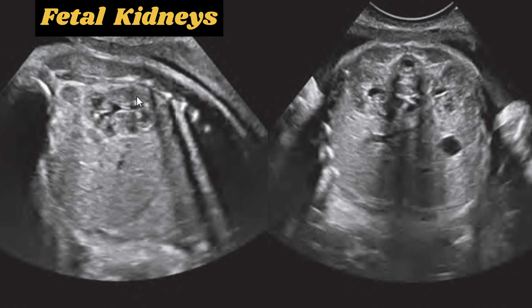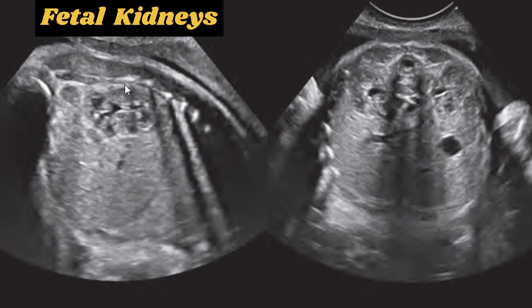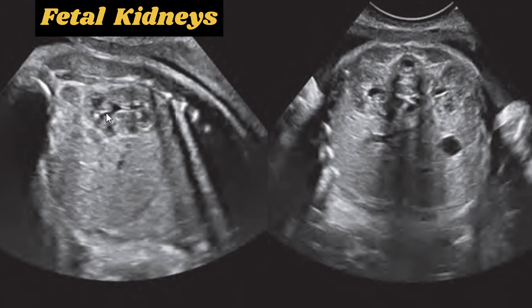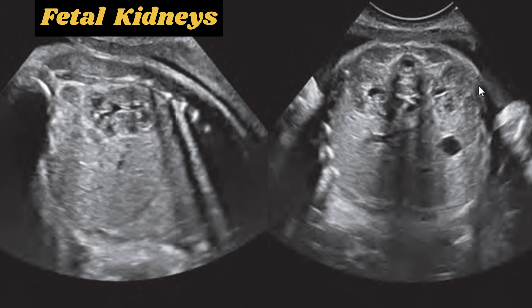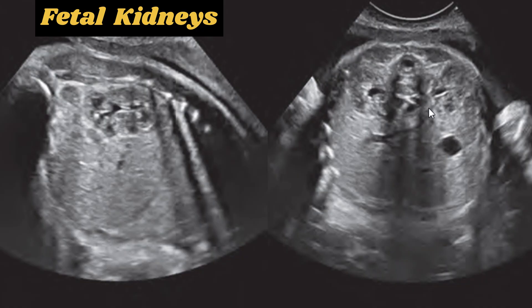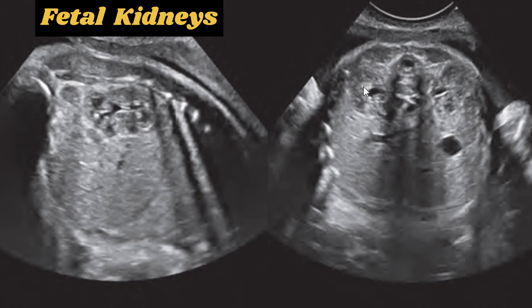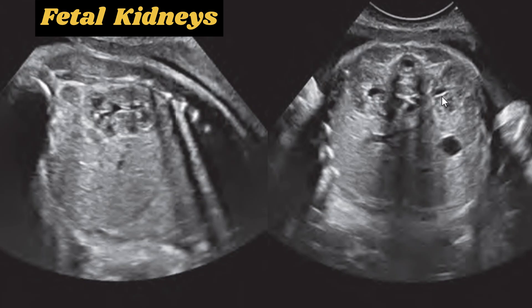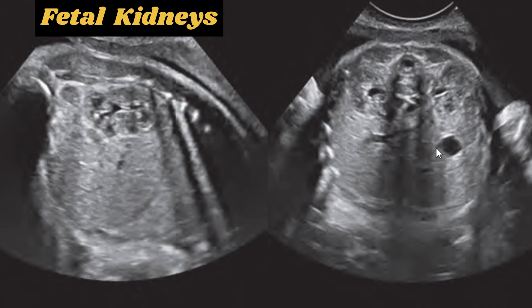Here we can see the kidneys of the fetus. This longitudinal image of the right paraspinal region at 32 weeks of gestation shows the kidney as an ovoid structure with normal peripheral hypoechoic medullary pyramids, and a small amount of fluid is seen in the renal pelvis. The axial image of the fetal abdomen shows the kidneys on either side of the fetal spine, with the left kidney and right kidney both identified. A small amount of fluid is seen in the bilateral renal pelvis, and the stomach bubble is also visualized.